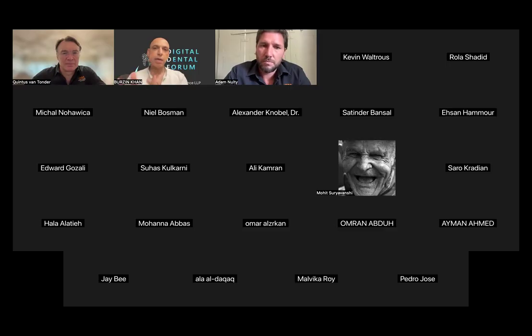So it gives the lab a data set to go by as to how much clearance there is, or what the inter-arch space is, etc., in the excursive movements. But when you look at devices like the Modjaw or the Zebris jaw tracking, that gives you exact analysis related to the TMJ and the facial analysis. So I think it's all about gathering more data sets, putting it all together, and making all the systems speak to each other.